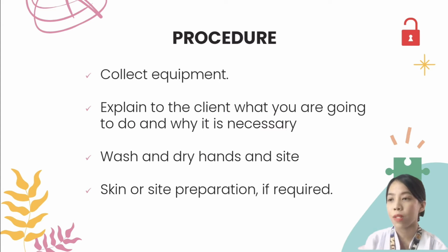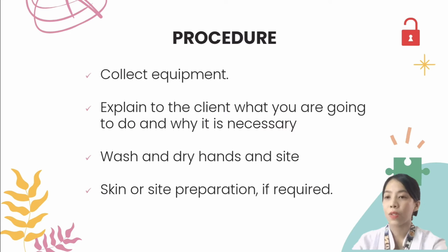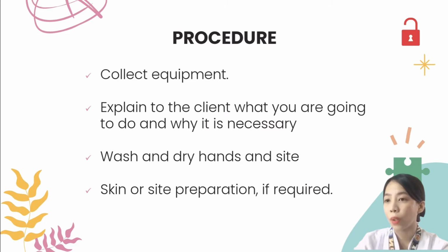Heel stick, if done, can be more painful and may require resampling, so we should consider pain management in the neonate. The preferred site on the heel is the lateral or the medial plantar surface for babies up to 1 year of age.